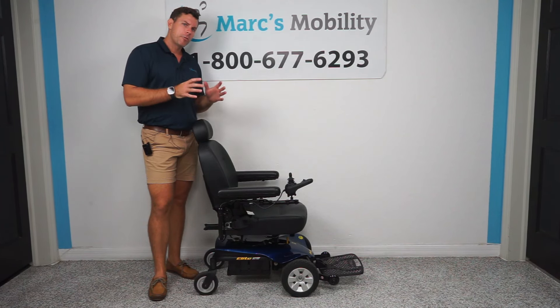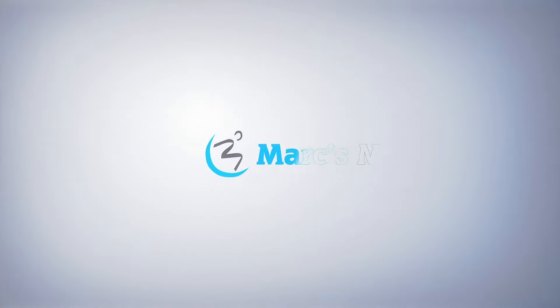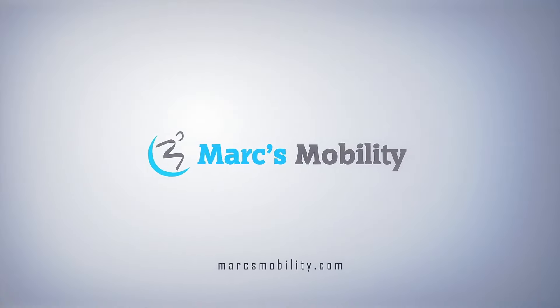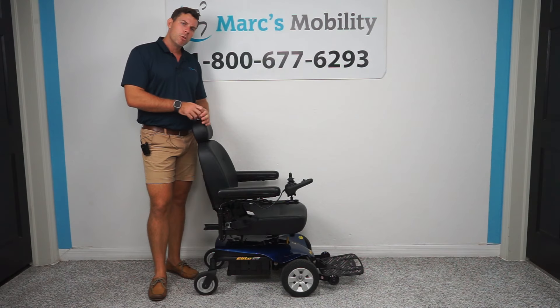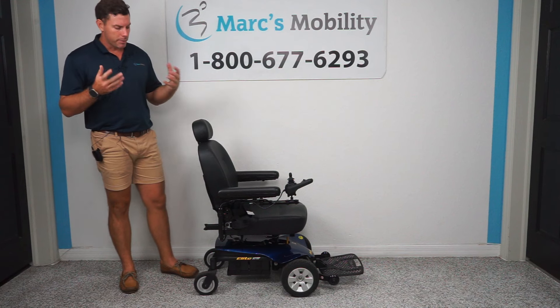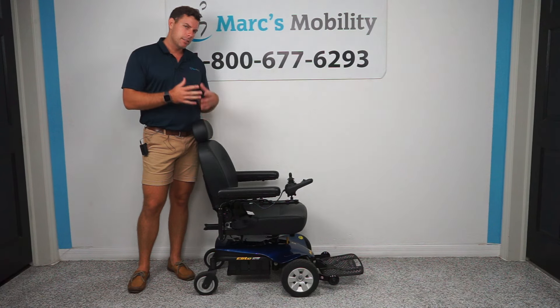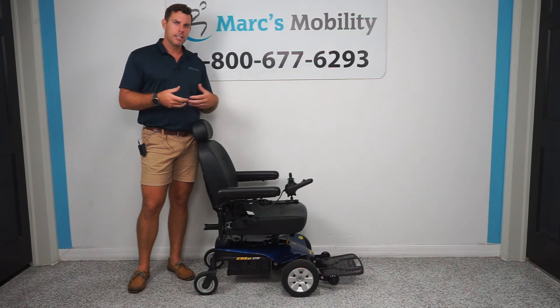In this video, we're going to show you a great basic power chair by Pride Mobility, so stay tuned. What we have here is the Jazzy Elite ES. Pride Mobility is one of the best manufacturers on the market. They make many different versions of their Jazzy Select, Elite, and Elite ES.